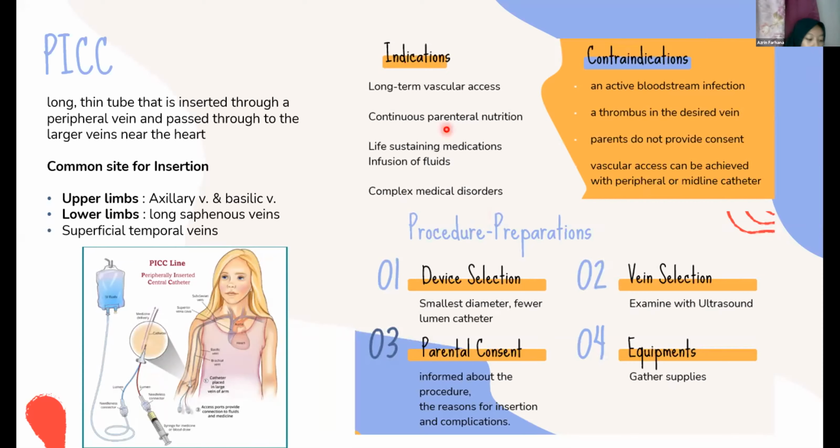So PIC is indicated especially in long-term inpatients who require long-term intravenous access. For example, very low birth weight infants, which require continuous parenteral nutrition, or infants who need life-sustaining medications, and patients with complex medical disorders, patients who need infusion of fluid.